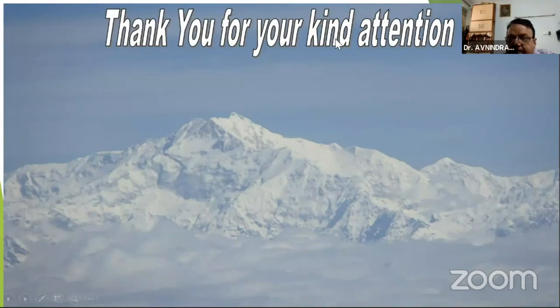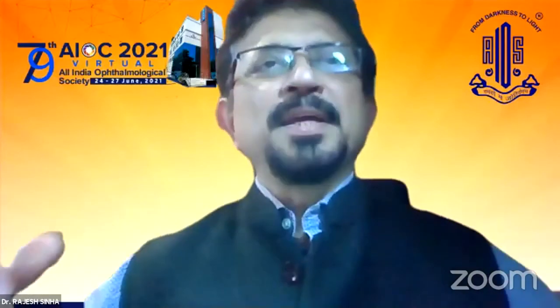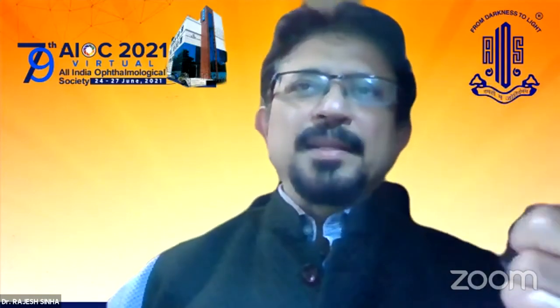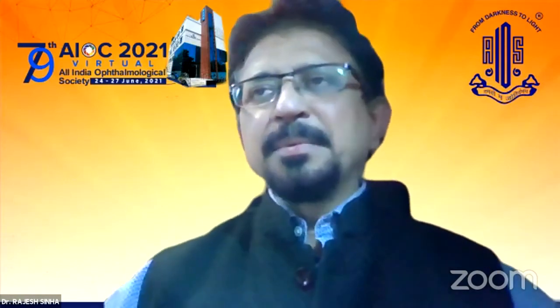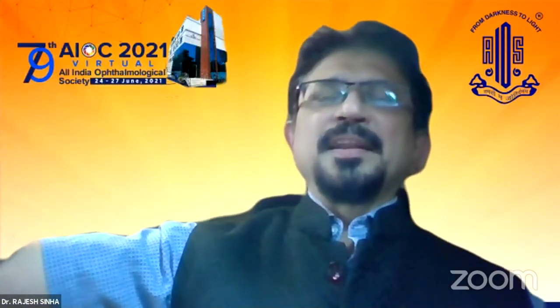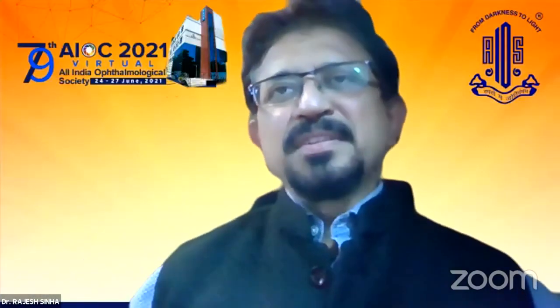Thank you very much. That was fantastic. Fantastic, Avnindra, showing so many complicated cases and coming out with very good solutions. Just one thing I would like to add here that I've seen, because we do encounter residents doing it, even I have committed a mistake. You were talking about the sclerotomy. I also use between 1.5 to 2 millimeter position. The only thing is that the direction of the entry should be directed towards the center of the globe. Otherwise it catches the iris.